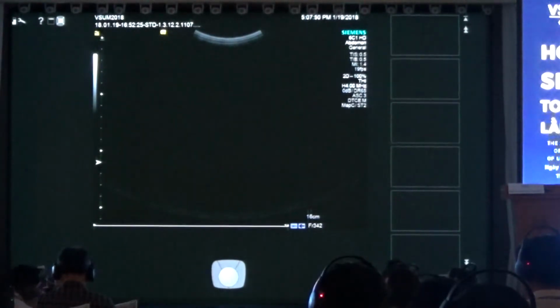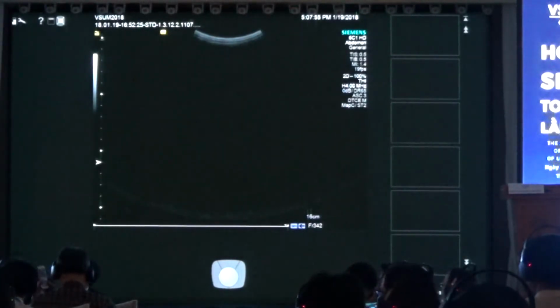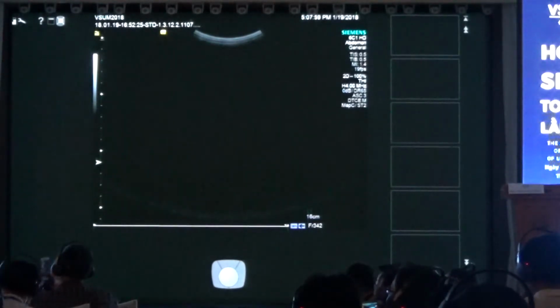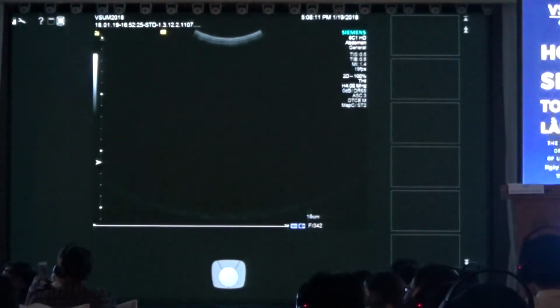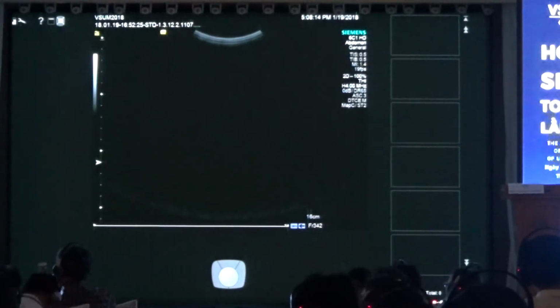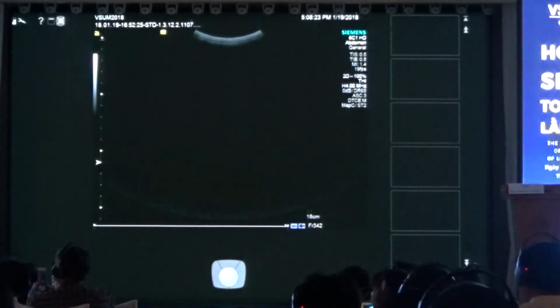Then, before we are doing the examination, we have been doing a physical examination, asking the patient if there is any congestion, any chronic heart failure. We check if the laboratory data are pathological, and if the transaminase is higher than normal values, because 5 times normal values will give you really bad results, inflammatory reaction. And then we start to interact with our patient.